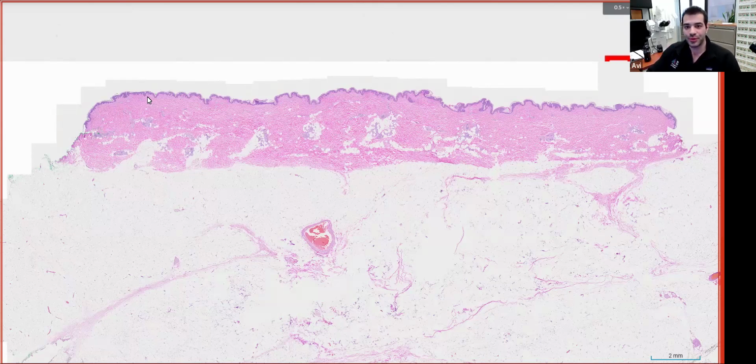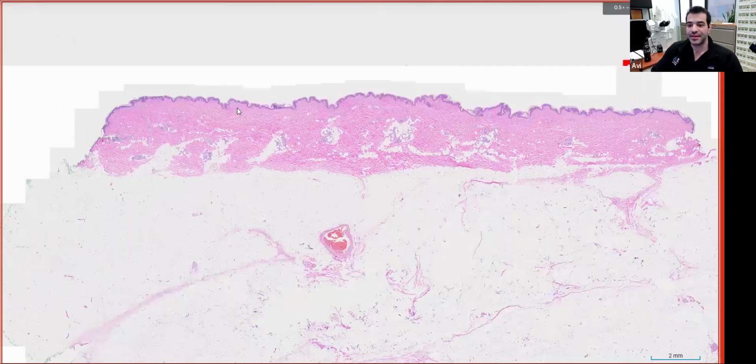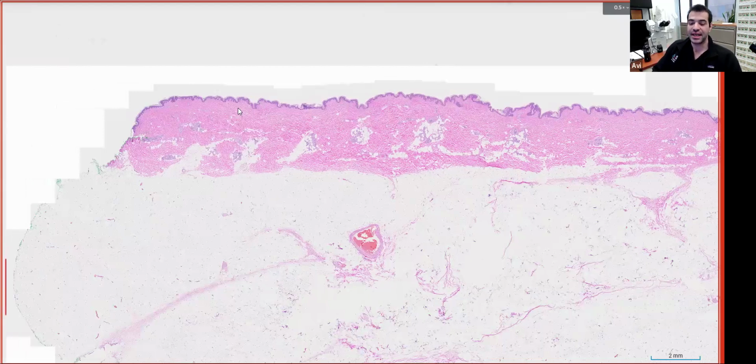On how to improve your experience with digital dermatopathology, how to make your practice more efficient, and how to make your diagnoses more accurate using the digital systems. For those who don't know, digital pathology in general is an up-and-coming field in which instead of signing cases out on physical slides, one looks at the scanned image of the slides and makes the diagnosis.